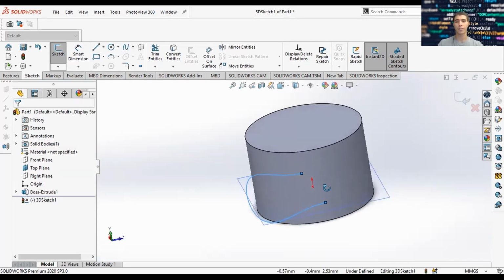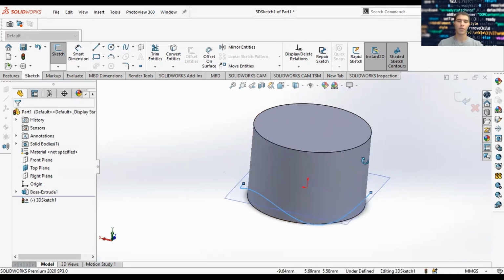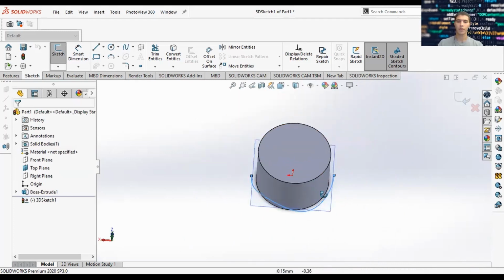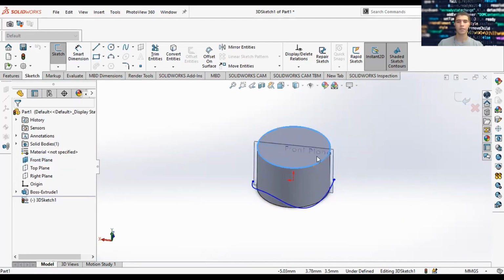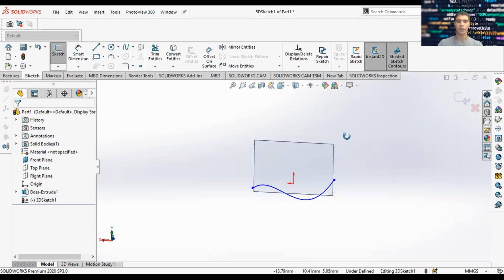And what we have right now is a cylinder with a function-driven curve, or an equation-driven curve. So what do you want to do next? This is what you want to do next. And we did it in a way so that it goes through half the cylinder. So now let's hide our top plane, go to our front plane. Let's hide this solid body. So now we have our curve, and we have our front plane.